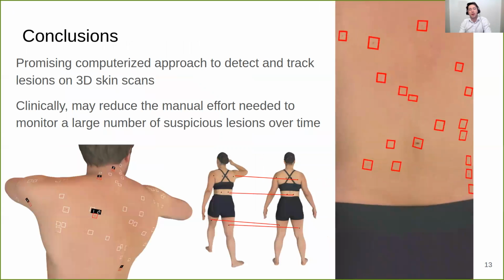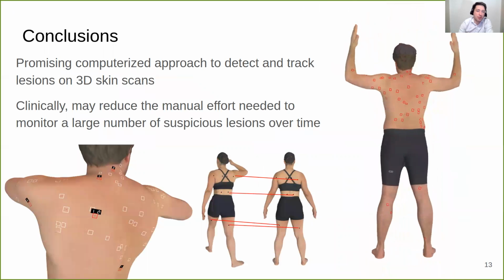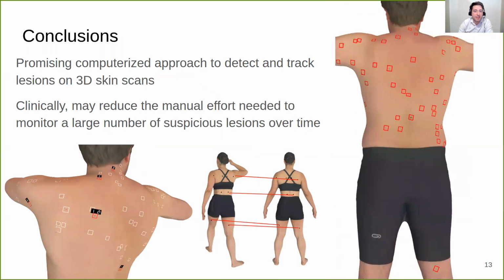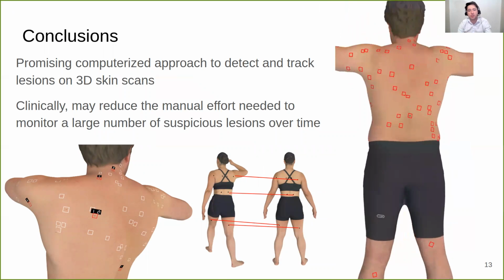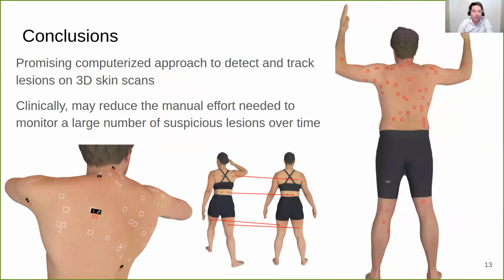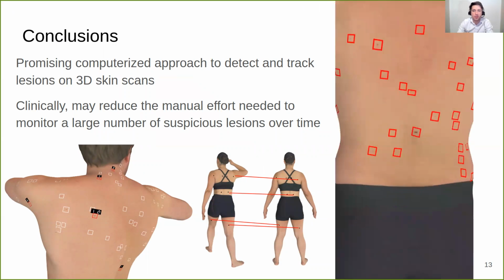So to conclude, we've presented a promising approach, a computerized approach to detect and track lesions on 3D skin scans. And clinically, the hope is that this could potentially reduce the amount of manual effort that would be needed if we wanted to monitor a large number of suspicious lesions over time.